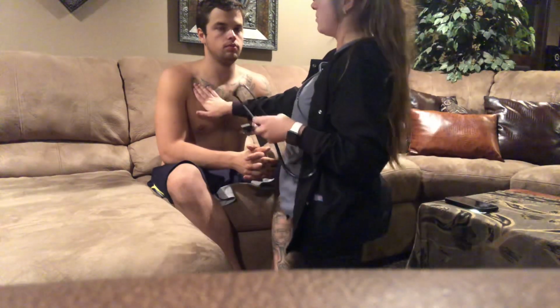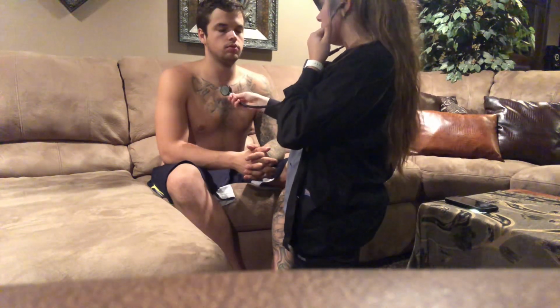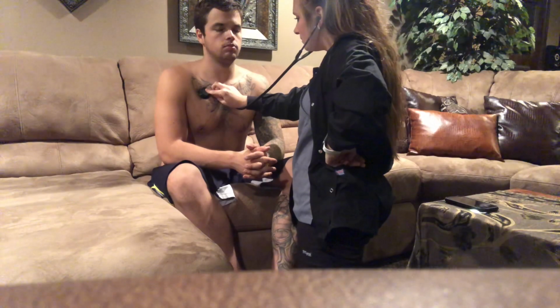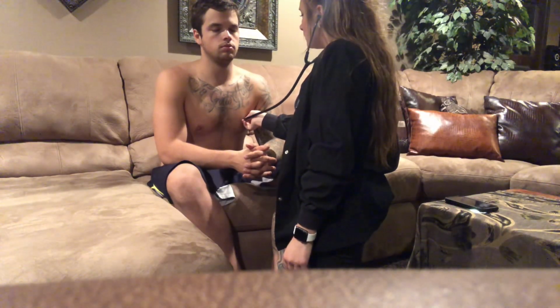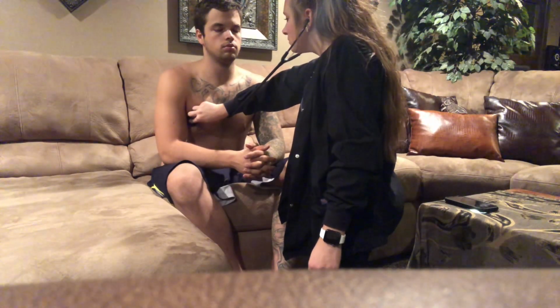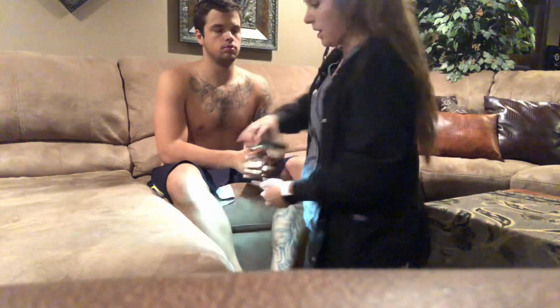So I'm going to go ahead and auscultate, and I'm going to start in the right upper lobe and then compare it to the left and work my way through all the lobes anteriorly. And I'm listening for a full cycle of inspiration and exhalation. And I'm going to count the rate.